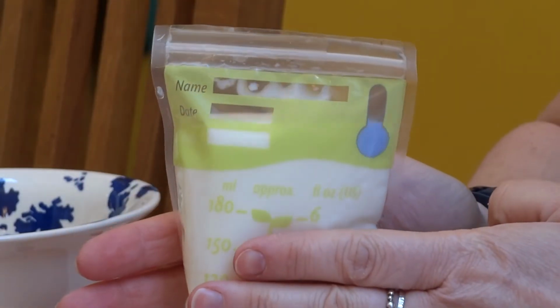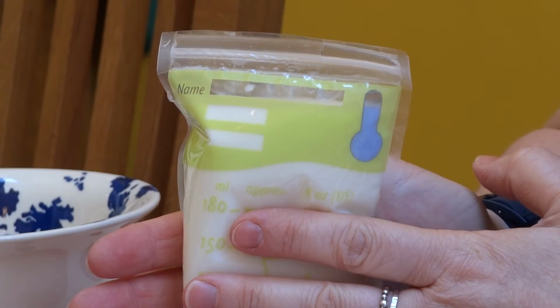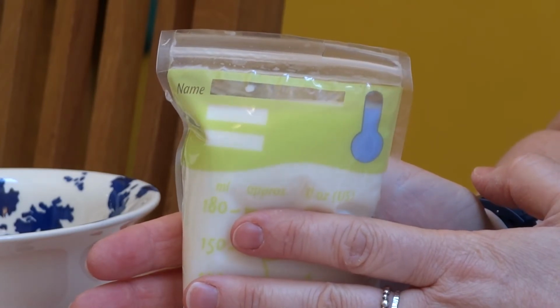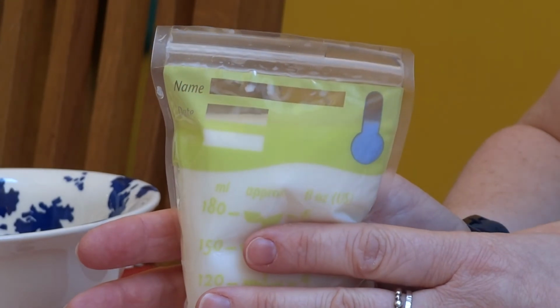Now this particular milk came from the fridge, and you can see that the temperature gauge has a bluish tinge to it, so that would be too cold for baby. If the temperature gauge was grey, the milk would be a bit too warm, but if it was completely clear and transparent, that would be the correct temperature to give baby.